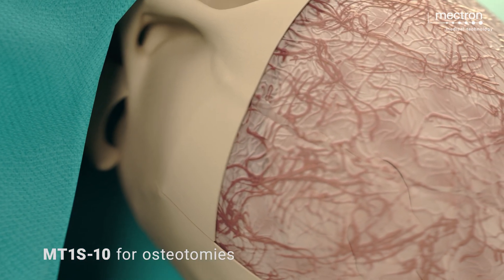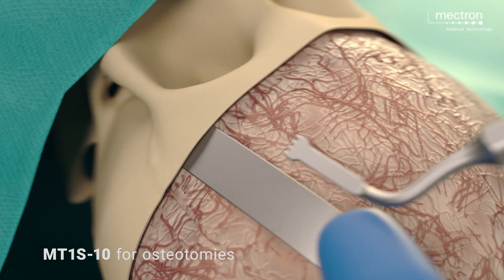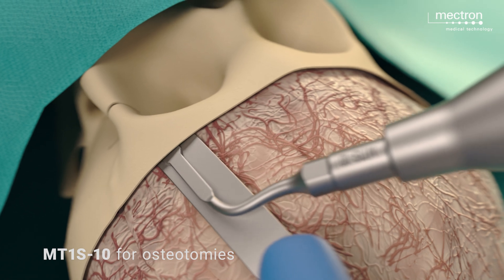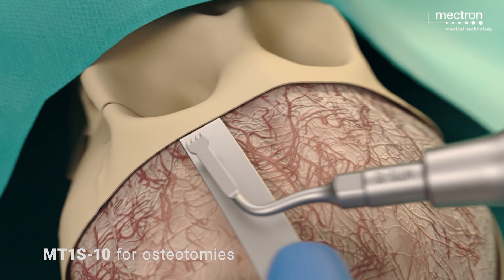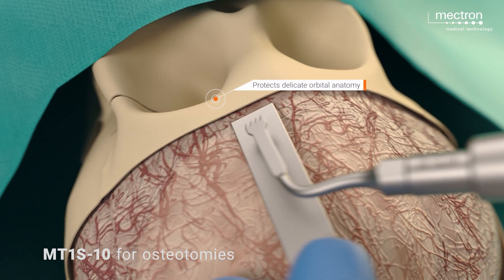The frontozygomatic sutures on both sides and the frontonasal junction are opened using the MT1-S10 insert. This exposes the frontal cranial fossa.